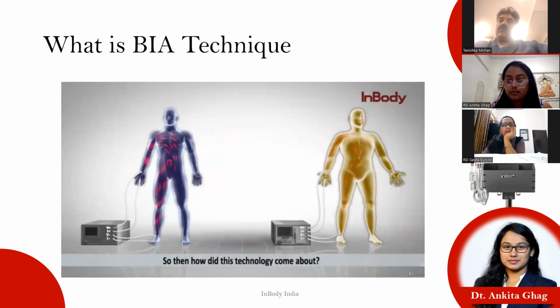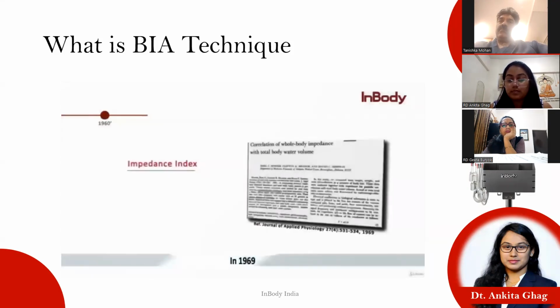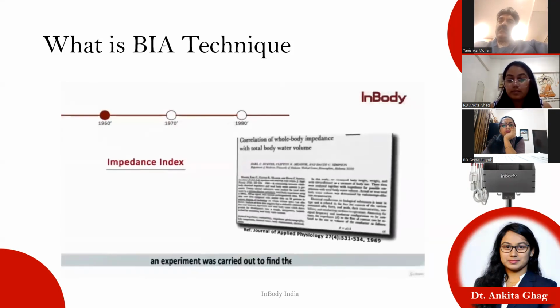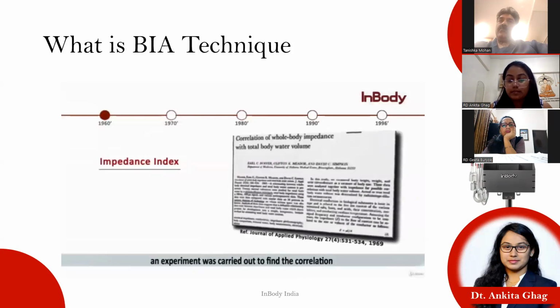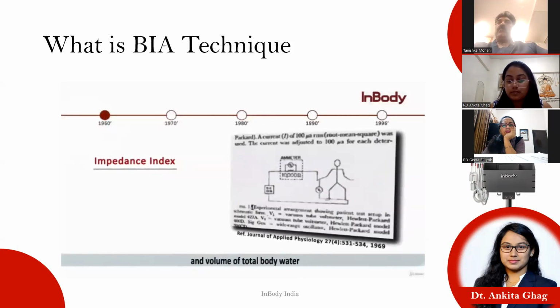So then, how did this technology come about? In 1969, an experiment was carried out to find the correlation between whole body impedance and volume of total body water.